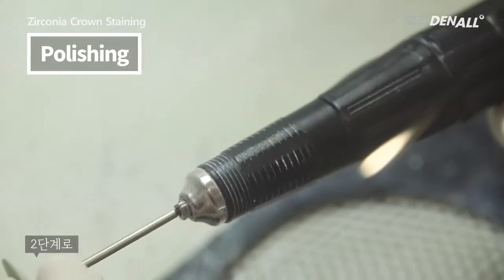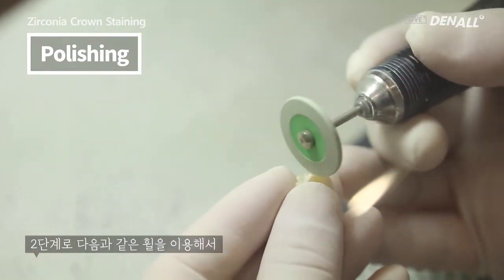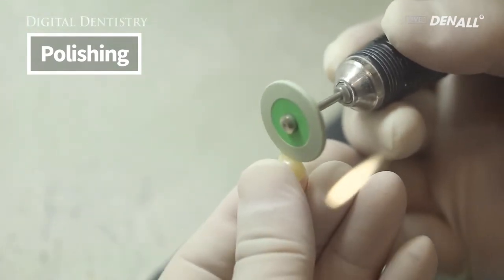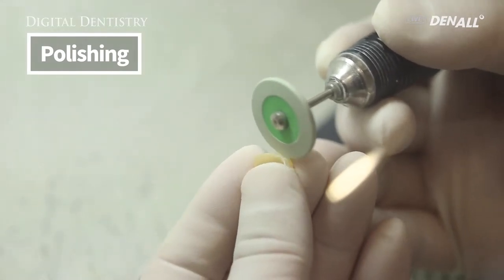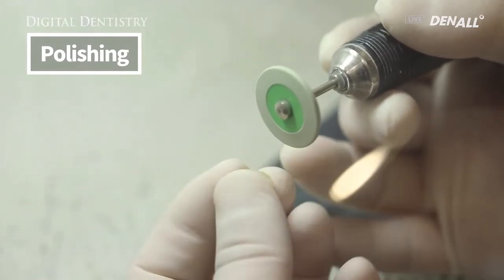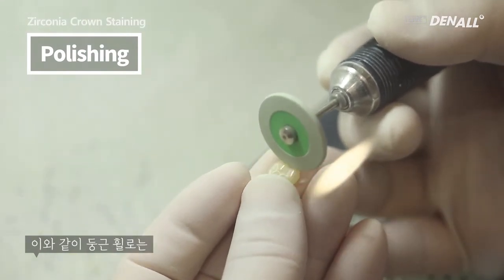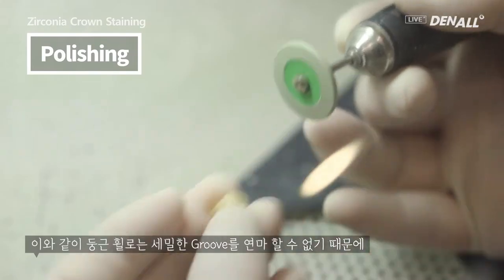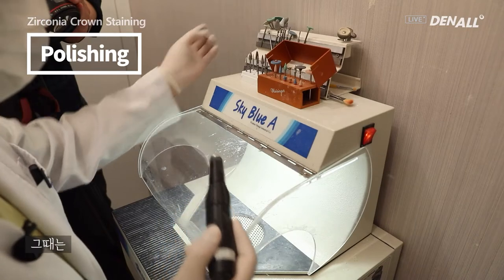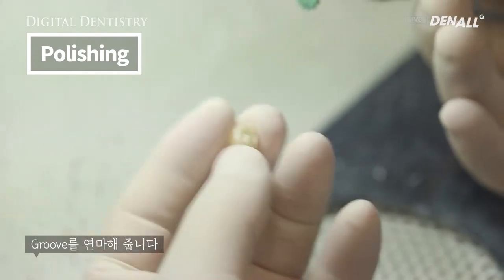In step 2, using a wheel like this, it is further polished. For the curved plane like the occlusal plane, the detailed grooves cannot be polished using a round wheel. For that, the feather-like wheel should be used to polish the grooves.